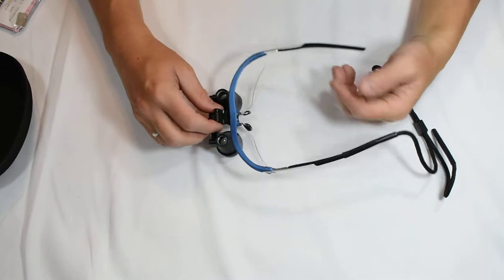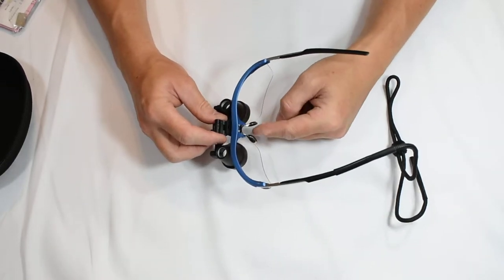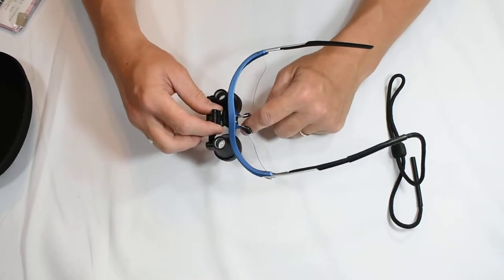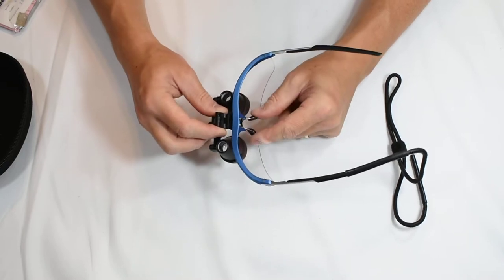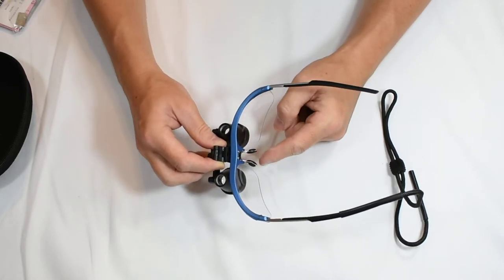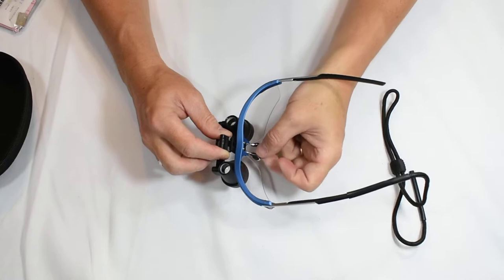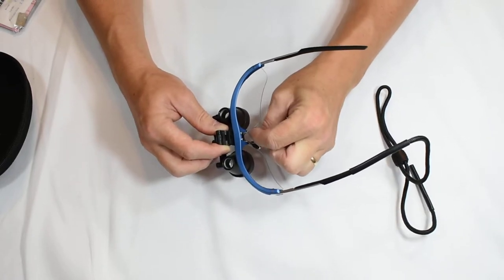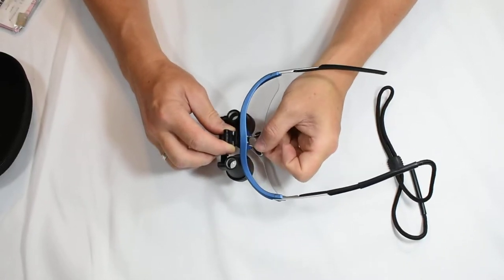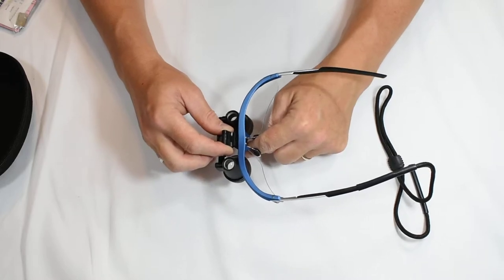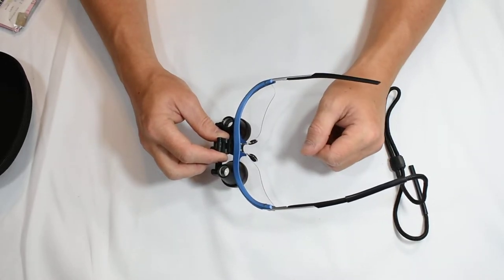Now another feature that you want to look at is adjustment to the nose pads. If you want the frames to sit higher on your nose you'll need to squeeze the nose pads together. If you want them to sit further down on your face or if you have a wider nose bridge, you'll need to open those up accordingly to what your needs are.